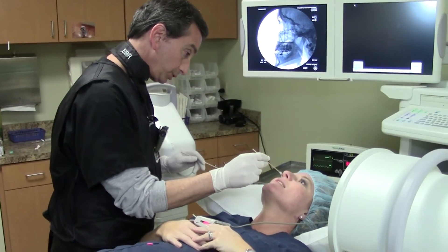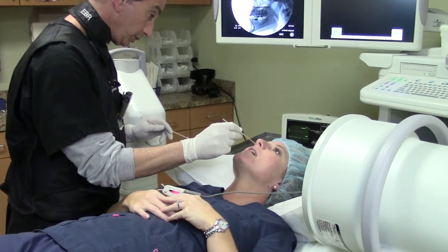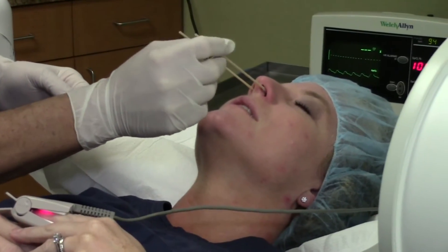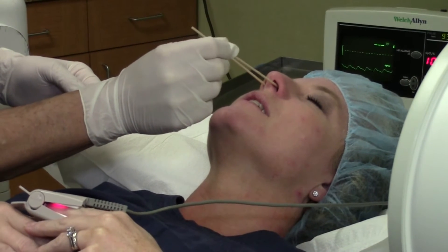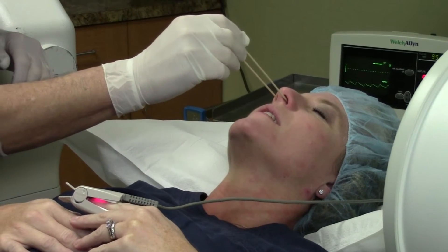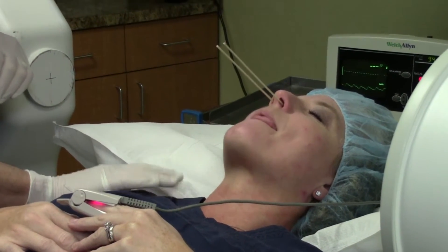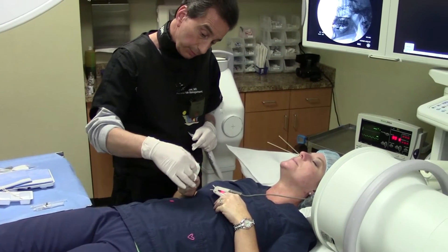The initial step is taking cotton swabs that are soaked with lidocaine jelly, and as you can see, I am going to anesthetize the nares bilaterally, and I will do this for several minutes. She is now ready to have the sphenopalatine block done.